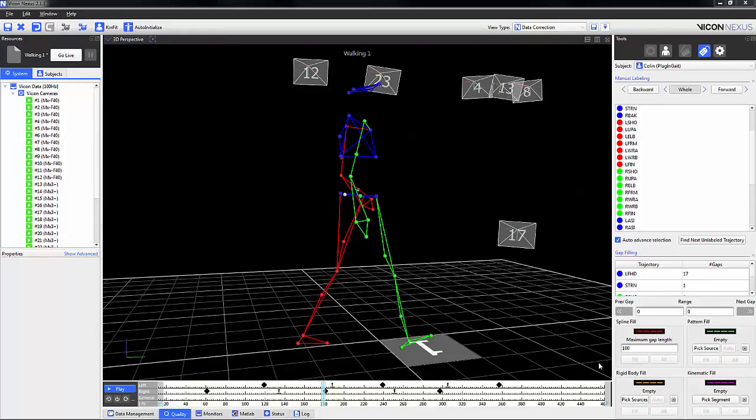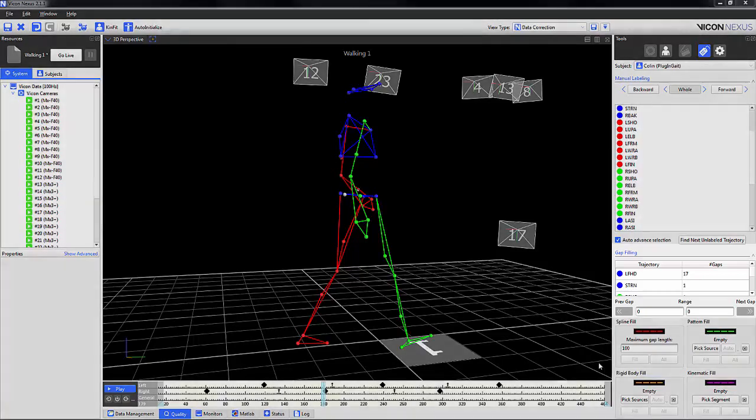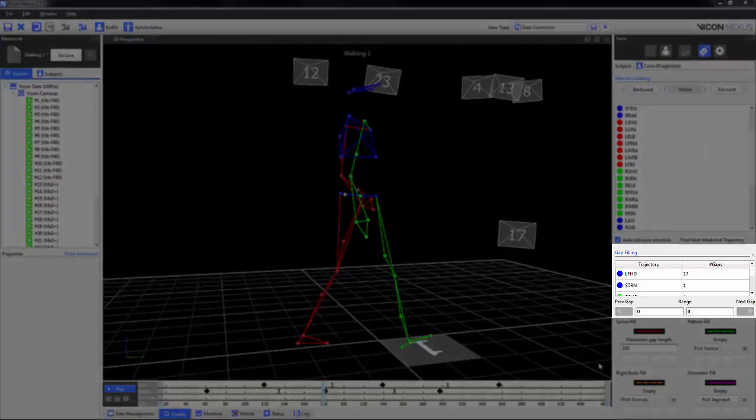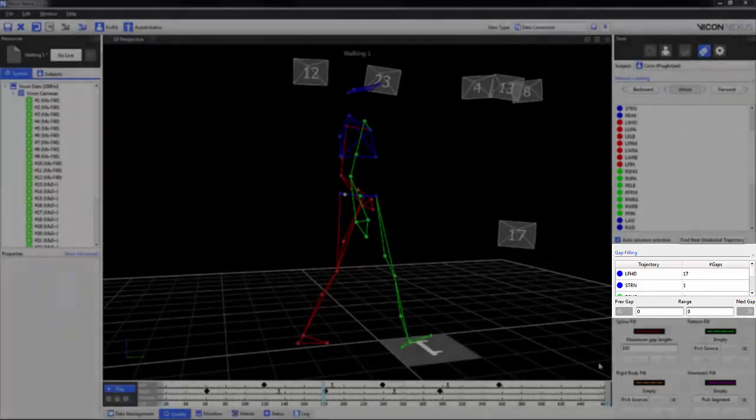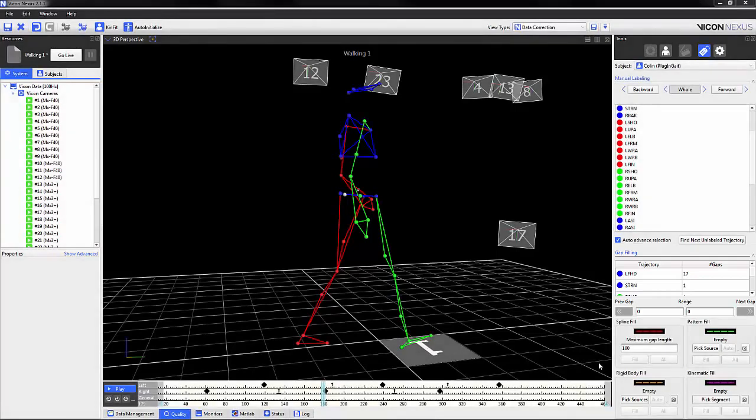Hi, today we're going to be talking about gap filling in Nexus 2. Like in Nexus 1, in the tools pane we have the marker and the gap filling list, where we have the names of the missing markers and the corresponding number of gaps.